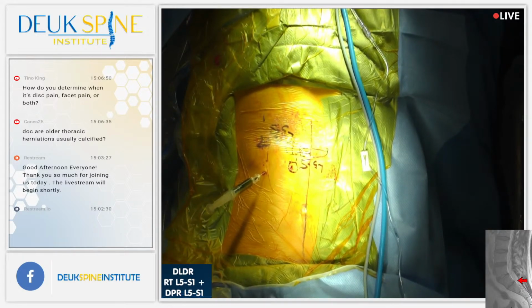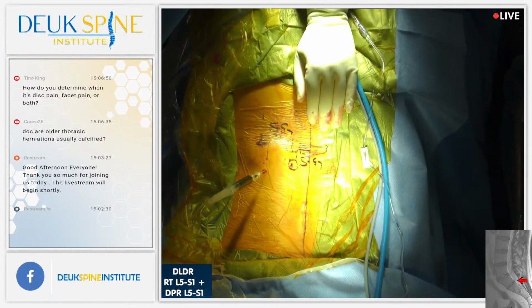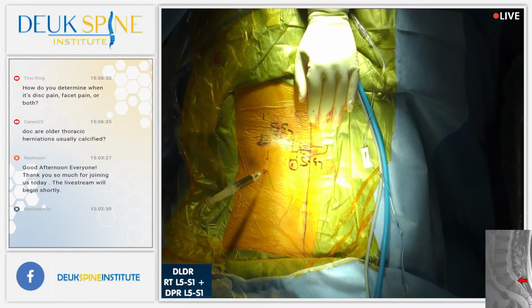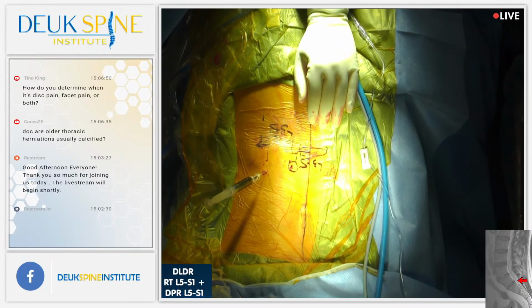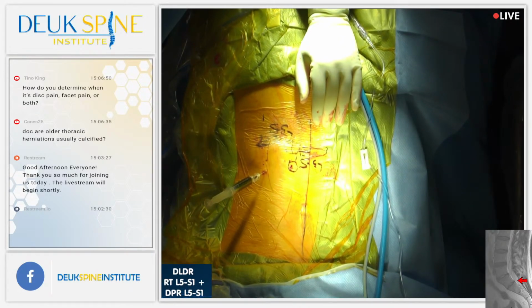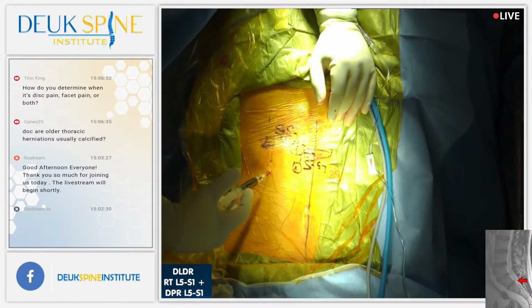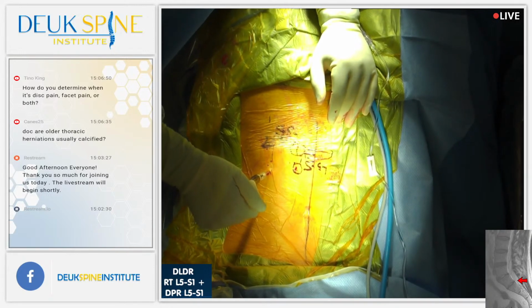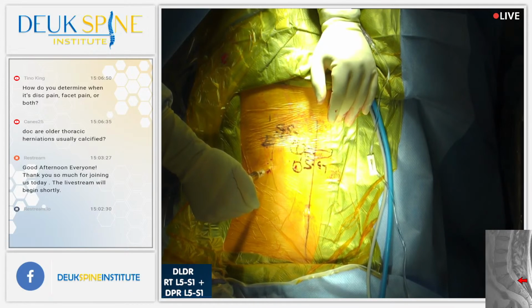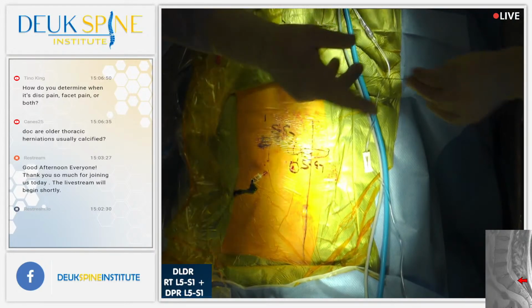All right, how's he doing? Are you having any pain? Where's your pain? Probably from the rhizotomy. Pain over his lower back. It's from the rhizotomy, I'm sure. Any pain down your leg, sir? No pain down his leg. How bad is that on a scale of 0 to 10? 9. Is that where you get your pain? 9 over 10, discogram.